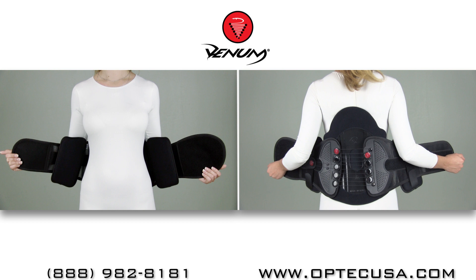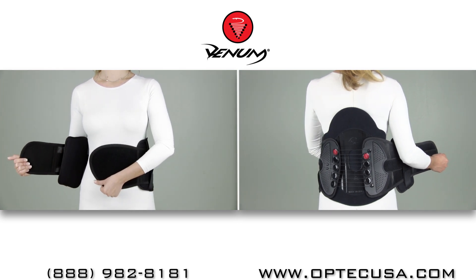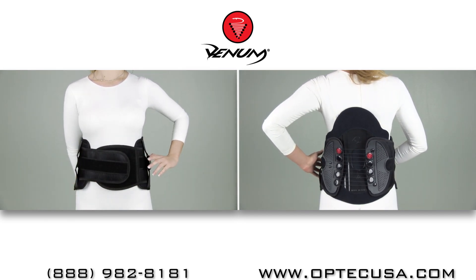Begin by holding the brace against your back as shown. Pull the left side across your body and hold it. Now pull the right side over and press the two sides together. Grab the compression string handle on your left side.